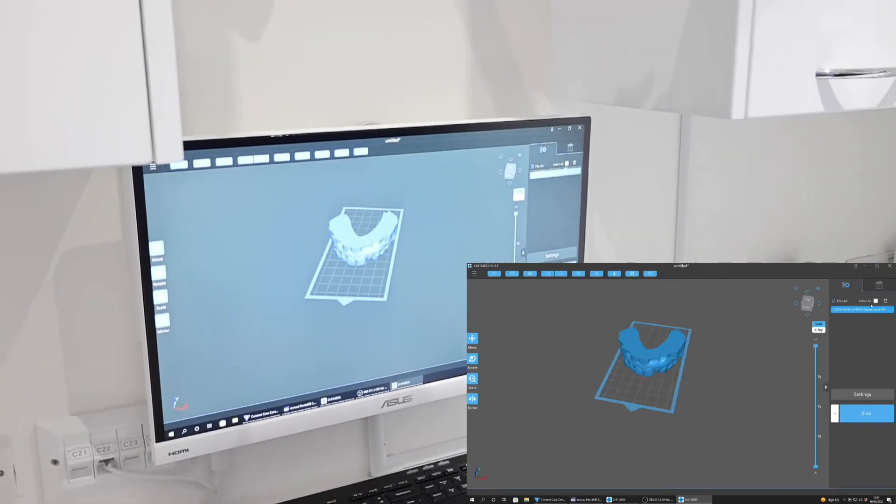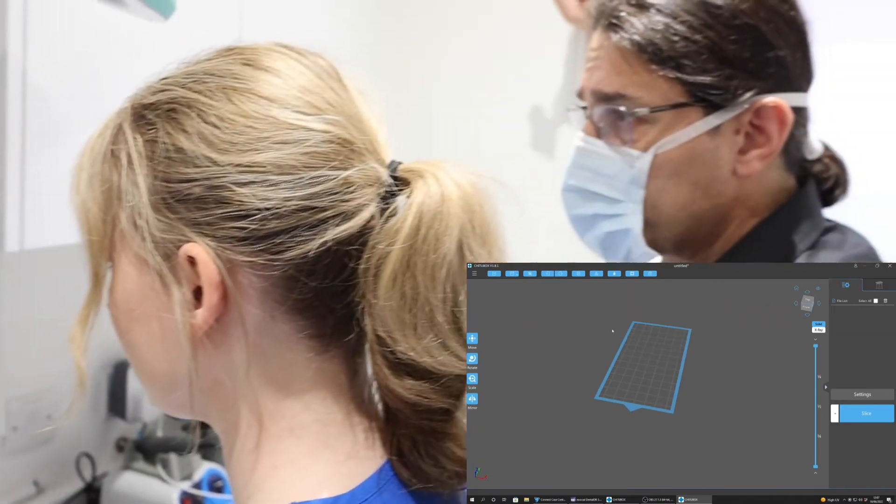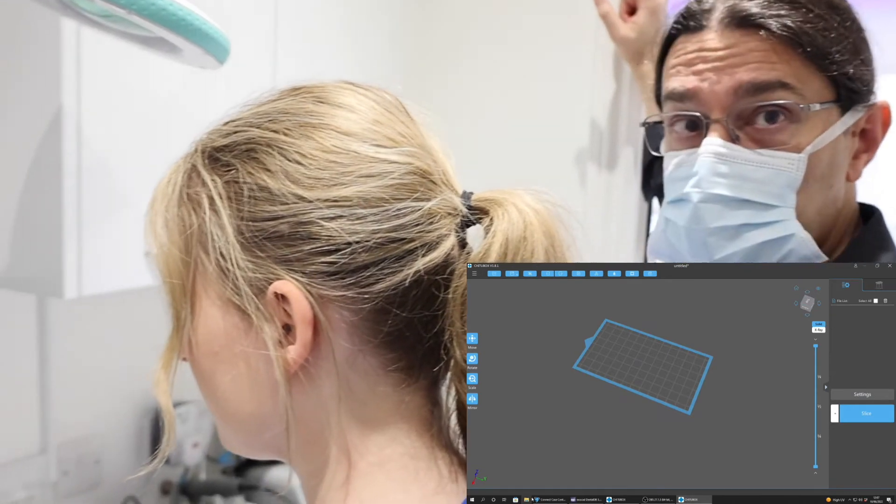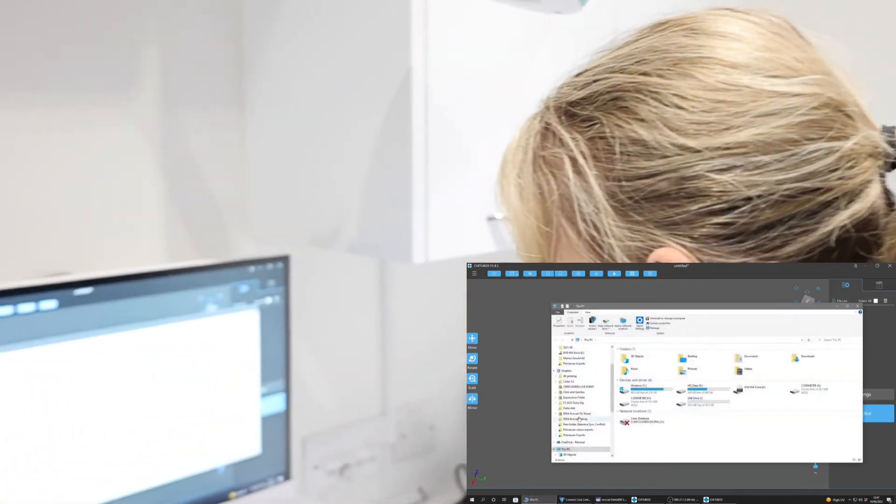What we see here is the direct import of those STLs from Connect as a closed model directly into the slicer software.